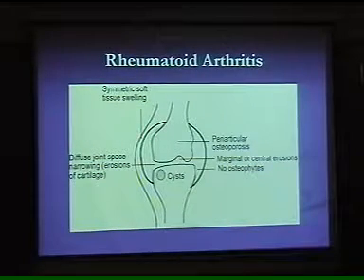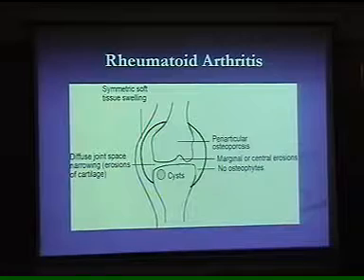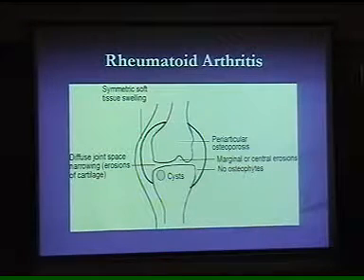How are you going to see it radiologically? The first thing on the X-ray of the hand, most commonly, is the metacarpophalangeal joint. That is the first thing they are going to involve. And what is the positive finding on the X-ray? If you look at the whole X-ray, the hand will show soft tissue swelling.